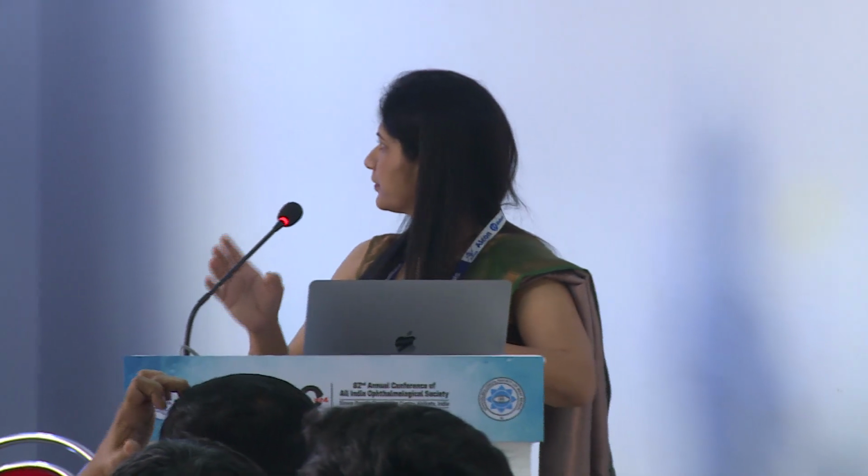Yeah. So without much delay, let's move on to the other aspect of this particular imaging system, which is the retro mode. I would request Dr. Shilpi Narnavre to familiarize you with this particular new entity. Good morning, everyone. Thank you for this opportunity. So I'll be speaking on the retro mode. It is a new investigative tool which specifically images the RPE.